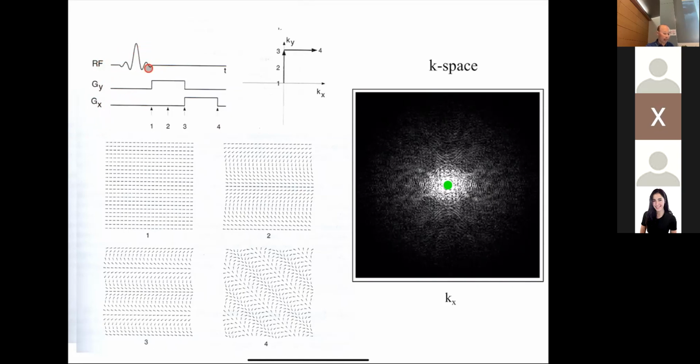And here we're just showing you the amplitude. Typically, you might want to see the amplitude and the phase of the RF. But that basically determines everything. Basically, the RF and the gradients, you control those. At every point in time, you can control them, and that becomes the playground for MRI physicists and engineers.